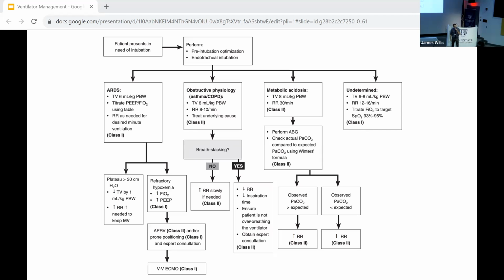Right away, just let them breathe on their own. They don't need to be in a controlled mode. In fact, that may make them more uncomfortable. So their sedation needs may be zero, nothing. Breathing spontaneously, they may be able to ambulate while this is being resolved. Not in the ED, upstairs in the ICU.